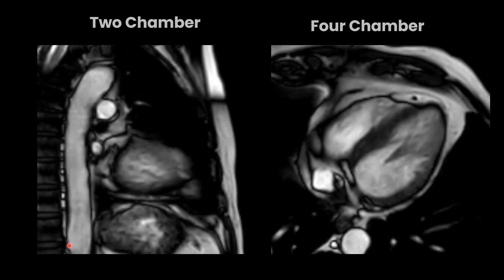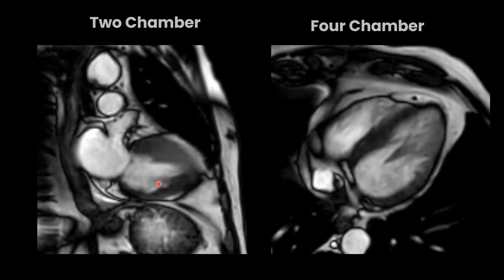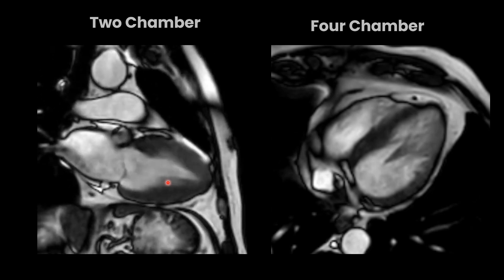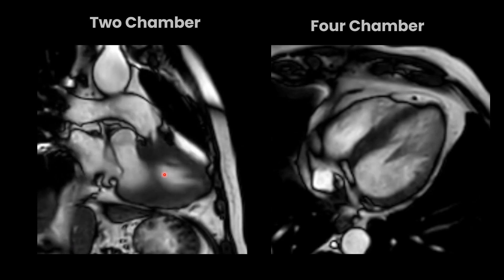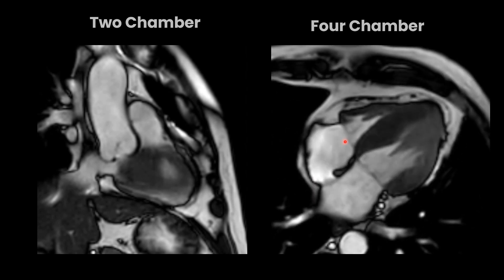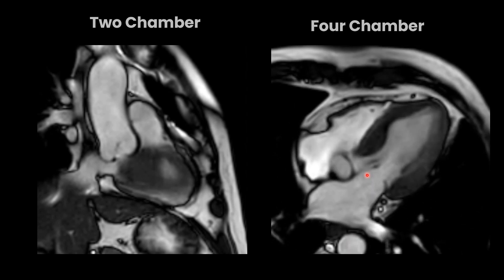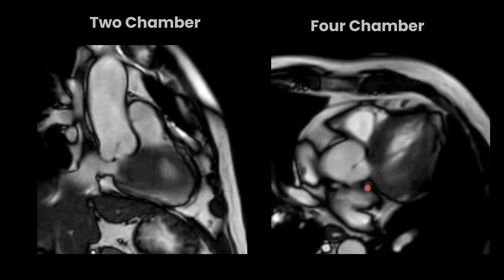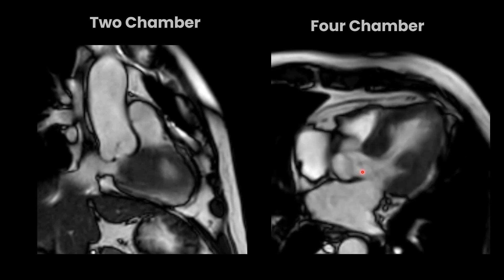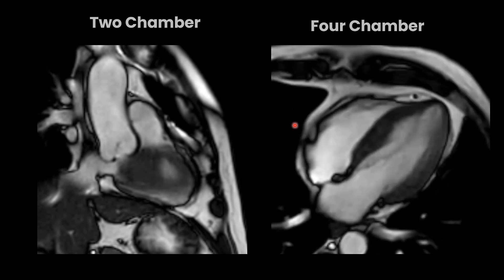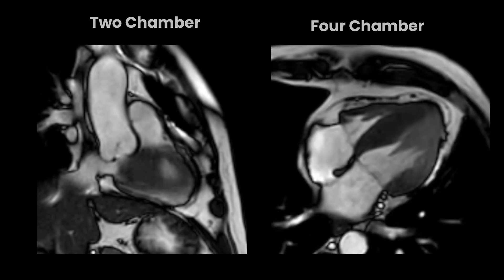This is the two-chamber view where we are able to see the left atrium, left ventricle, and mitral valve, along with papillary muscles and movement of blood, which is beautifully seen. This is the four-chamber view again showing right atrium, right ventricle, left atrium, left ventricle, mitral valve, tricuspid valve, aortic valve, and mitral valve continuity with jets of blood. These are the three important views: two-chamber, four-chamber, and short axis.